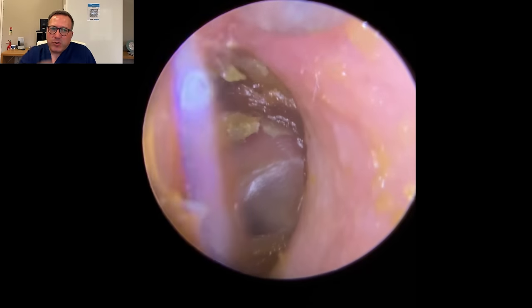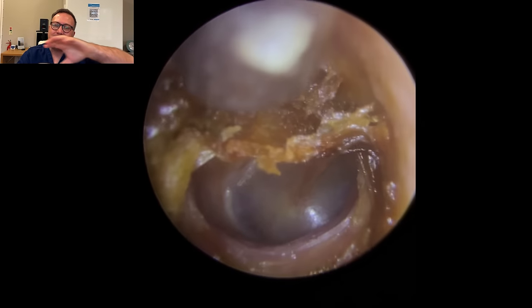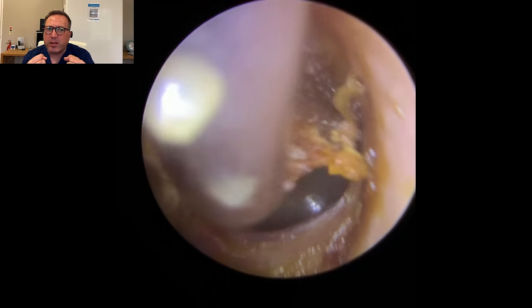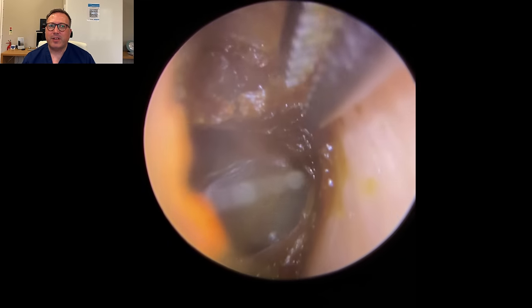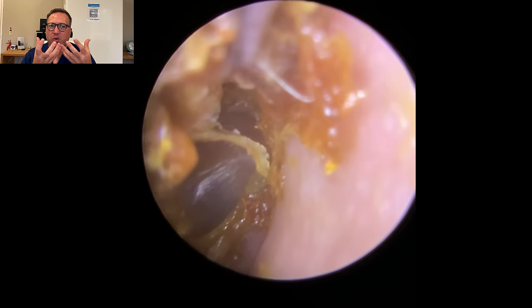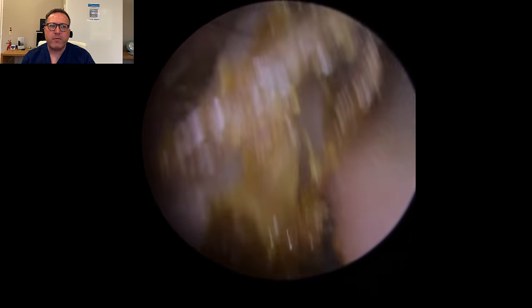You can see that plug - quite a large plug. Interestingly, if you look, can you see this sleeve of dry skin all around the outside edge we were talking about earlier? Look as we pull this down how it detaches from the canal wall. Really interesting case this one, because normally dry skin will form these little lifts, but this formed a whole section of dry skin around the outside edge, really anchoring that wax into place. You can see as we pull this down how it all starts peeling. We'll get a good grip with the crocodile forceps - watch this as it comes away. As we pull down, it shears from the top and then draws the sides out with it, so it pulls the whole thing. You can actually see the sides sliding down the canal. So this sleeve of dry skin was really holding everything into place.